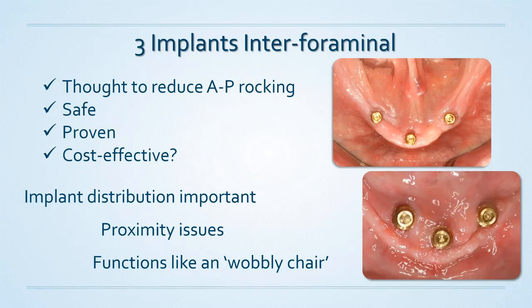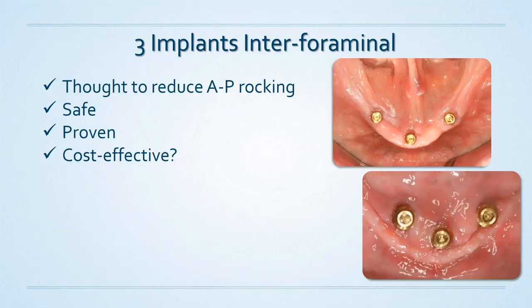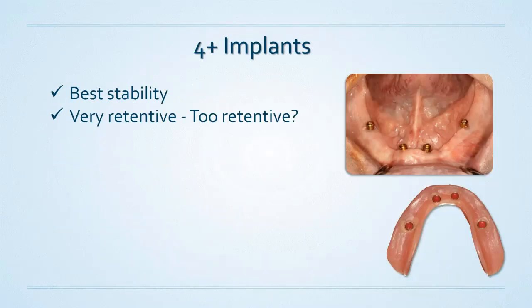And what happens is that I really have some issues with the 3 implant situation. It's not a bad way to go. Do a lot of clinicians have success with it? Of course. Does it work? It does. But in all reality, if your intention of placing a 3rd implant here is just to reduce some of that rocking, to tell you the truth, I'd tell you to skip that. In my practice, I usually either do 2 or I jump right to 4.